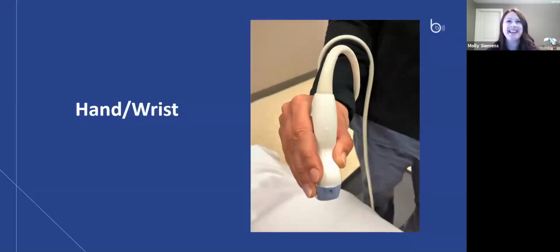Instead of squeezing the daylights out of the probe, I myself am guilty, we want to try the following. Try to avoid or at least minimize the activities that would cause you to grip the probe with that much force. I realize that this is easier said than done, especially depending on our schedule and the number of teammates that are available to help share those certain types of exams.